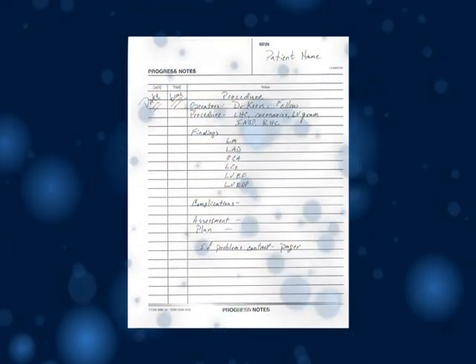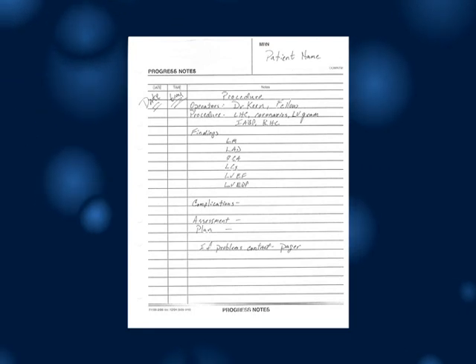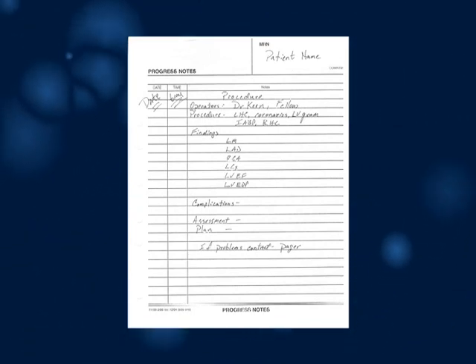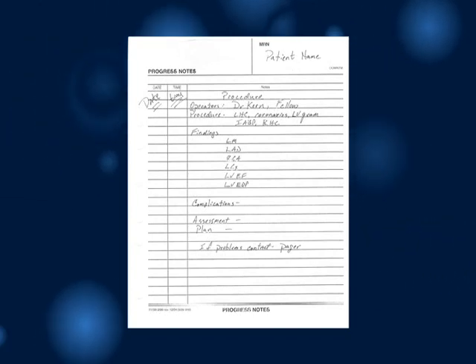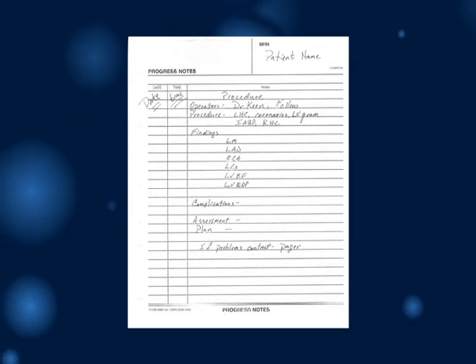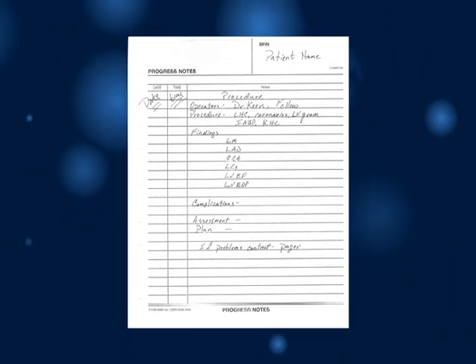Documentation of the procedure following cardiac catheterization is essential for several reasons. It is important for the operators in the future to know what was done. It is important for the doctors who are caring for that patient currently to know what was done and what the results are. And it's important for the administrative people in the hospital and in the cath lab to be able to appropriately bill for your procedures.